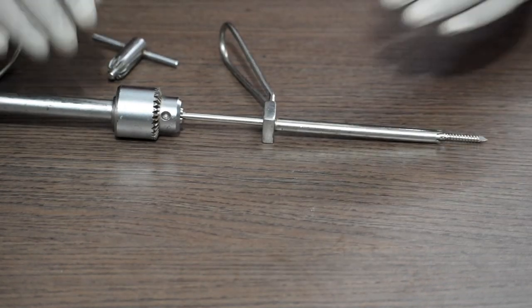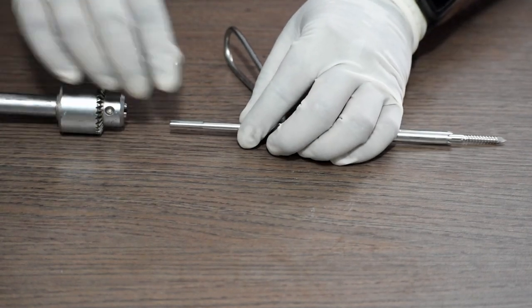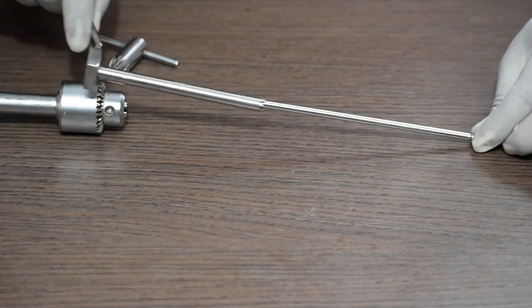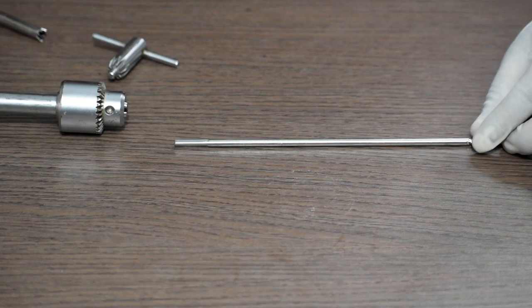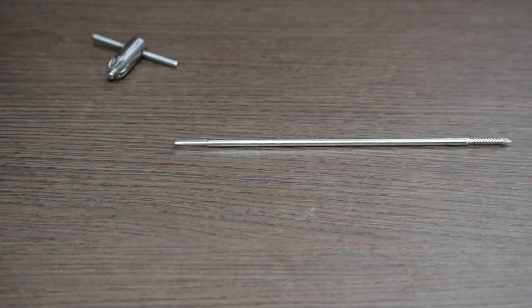Once the Schanz pin is inserted, we remove the T-handle chuck, we also remove the protection sleeve, and the Schanz pin stays back.